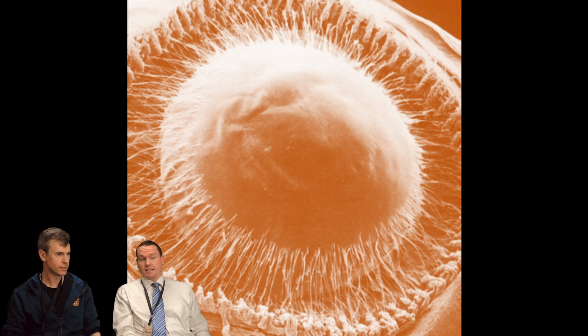And this is an interesting case of a patient who had a dislocated lens in clinic. Then we're going to see the time when they get to the operating room, and it's about gone. It's about completely dislocated at that point. I still remember in clinic, I asked her, do you notice anything? She's like, oh yeah, I see it. I can look through it, but there's a little part that is out of focus. She could still see it. I could see it. This lamp.